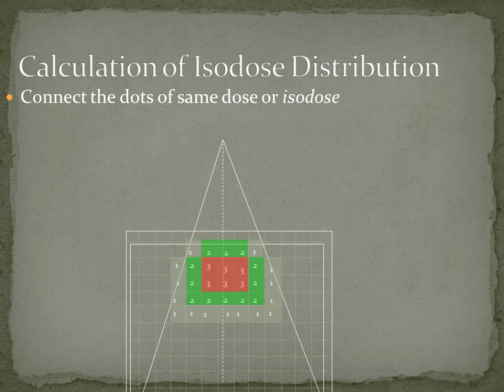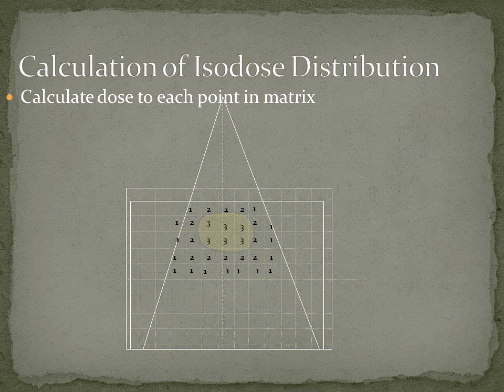And what you see here is another rendition of that. I've got the patient here, and the radiation beam goes in, and there are different intensities. The radiation beam is more intense in the middle, less intense at the edges, slightly less intense as it comes into the patient. It takes a little bit of time for it to build up its intensity, and then you get this high dose of radiation. What we normally look at are not these numbers. What we look at are what we refer to as isodose curves, which are curves connecting these common points of dose. So what I've done here is I've just produced an isodose region of the high intensity. So when you see an isodose curve, it basically is a curve connecting the edges of a volume which have similar doses. Okay.